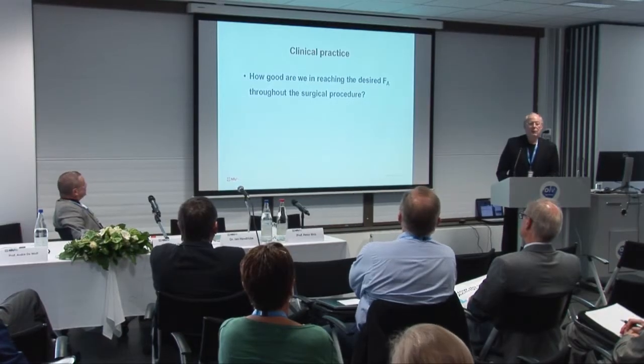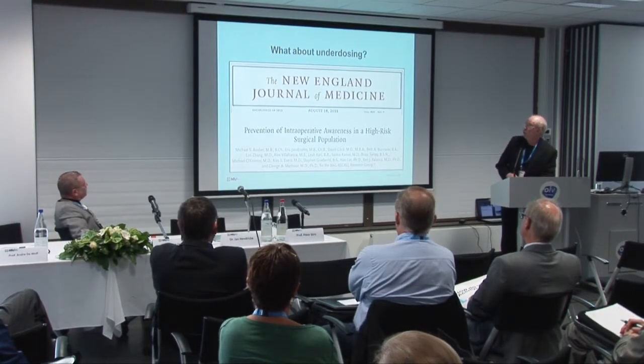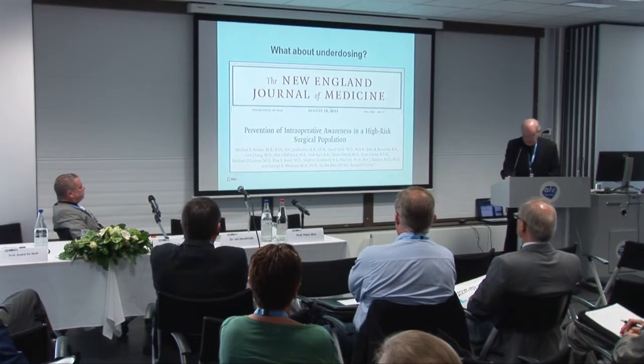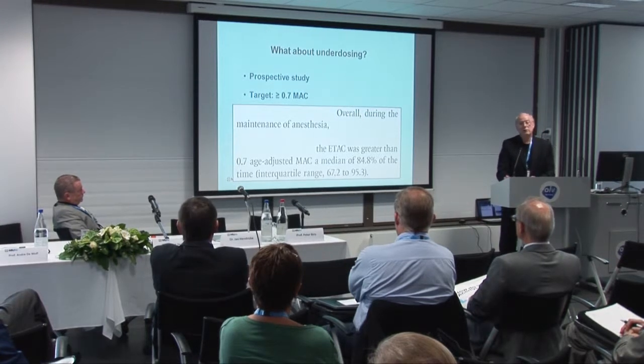Another issue is how good are we in clinical practice in reaching the desired FA throughout the surgical procedure. And to illustrate that we're not really very good at it, I'm presenting this study by George Mashur, which looked at the incidence of intraoperative awareness. So what did they do? It was a prospective study. The target of the potent inhaled anesthetic was 0.7 MAC.